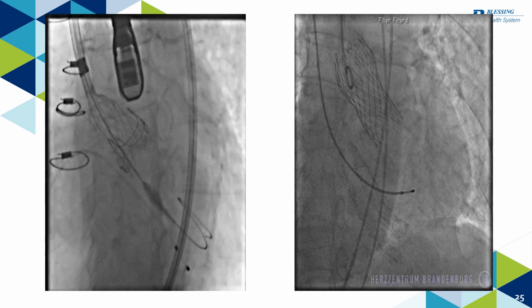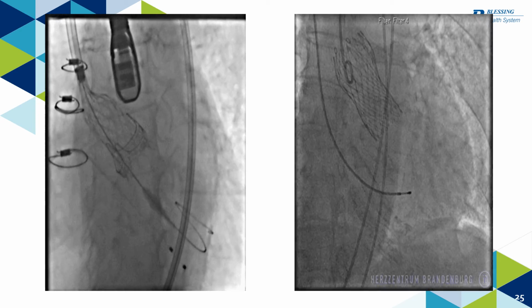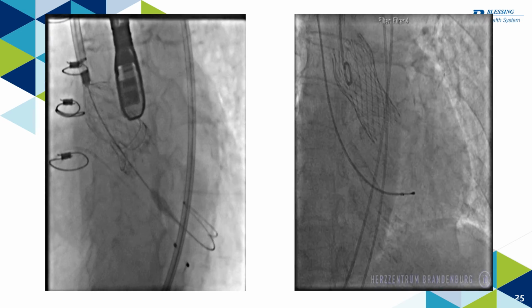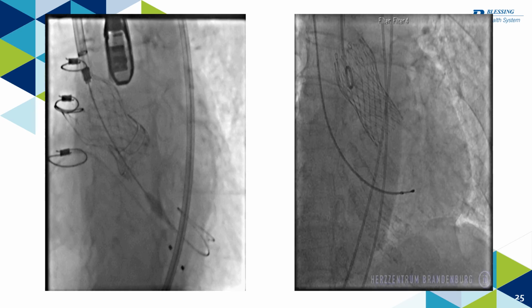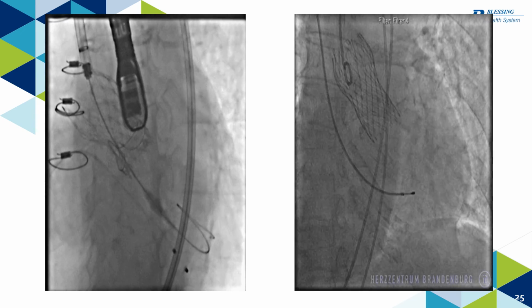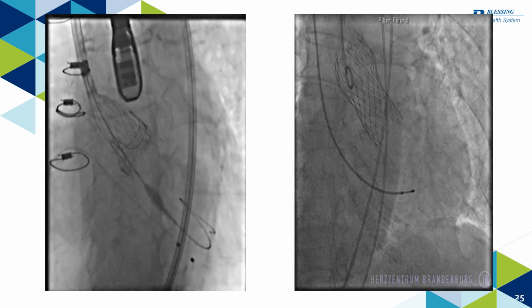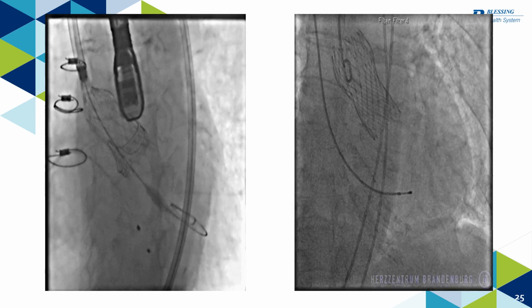This just gives you a live picture. I tried to find some others of the actual deployment of the valve, but this gives you an idea of the Medtronic valve. That is on the left. If you watch, it's being dialed up and then it flowers open. So you can see where it can be held onto at about 80%. And then to check, the probe you see at the top is the transesophageal echo probe.